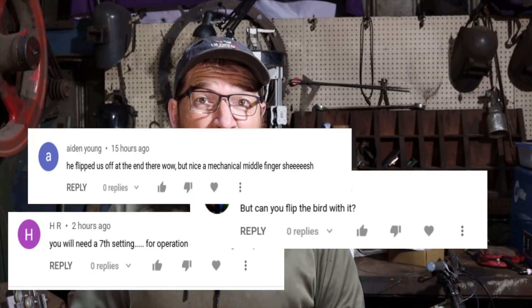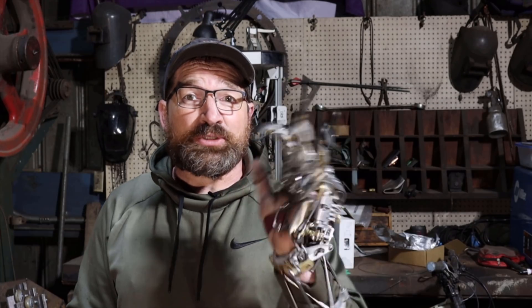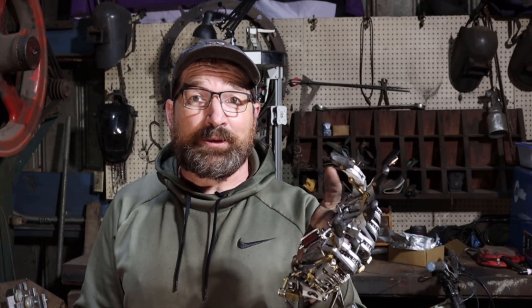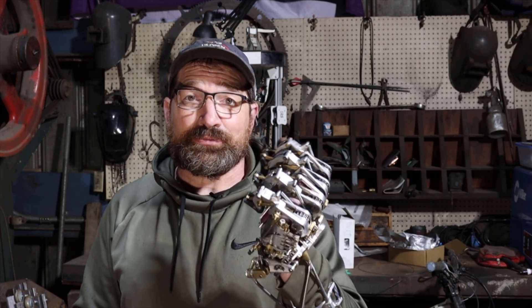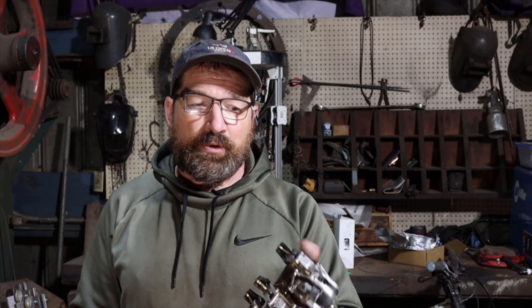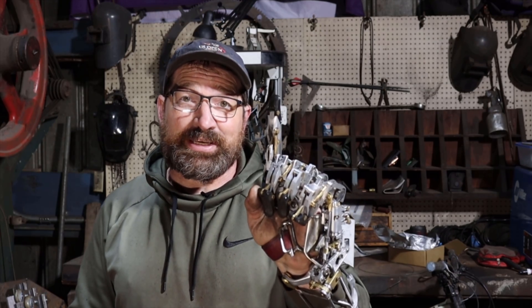I thought I'd take this opportunity today and make this video about all the different grip patterns that I have — except for one. First grip pattern opens and closes just like my normal hand. Second grip pattern, all the fingers are closed. Third grip pattern is index and middle. Fourth grip pattern is just the index.